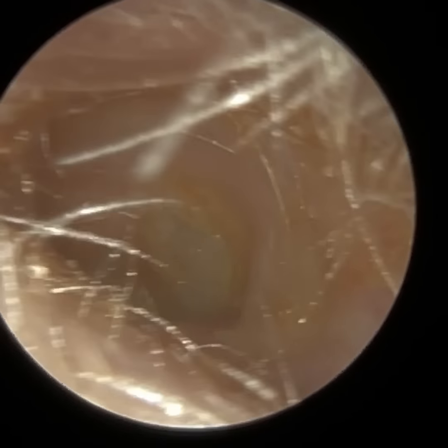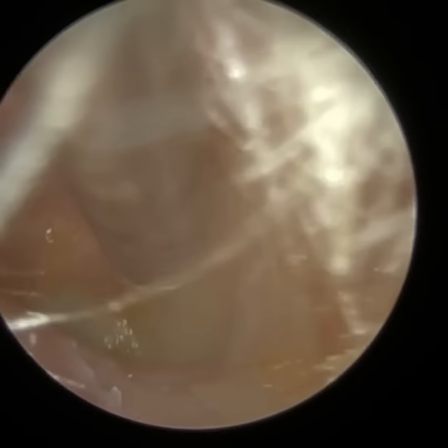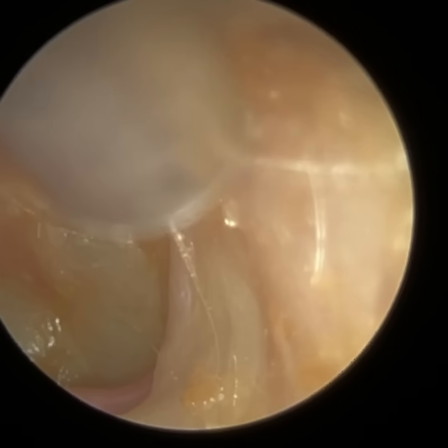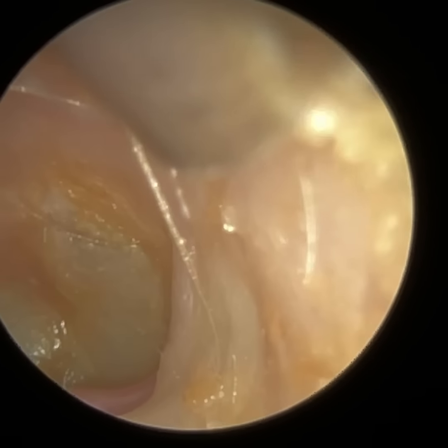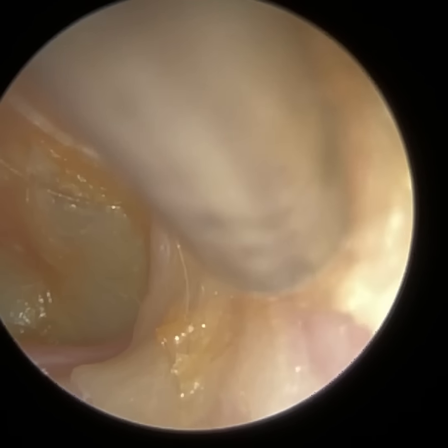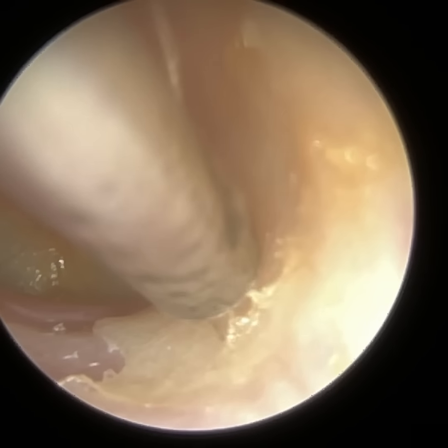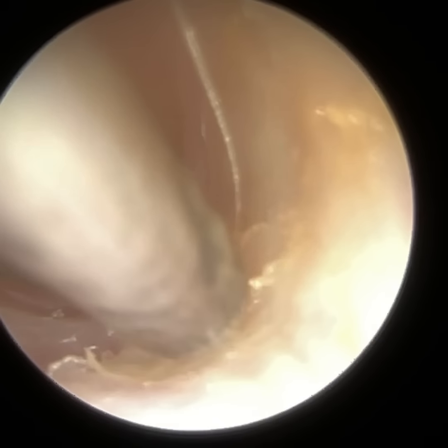And essentially, this patient's epidermis layer of skin, it's failed to migrate, it's died, and it's shed, and there's multiple layers like an onion, and they're sitting on top of each other. And even at this stage, the patient's hearing significantly better. There is going to be some residual skin, the thinnest layer of skin, that attempted to peel away, but then the patient experienced the caloric effect.